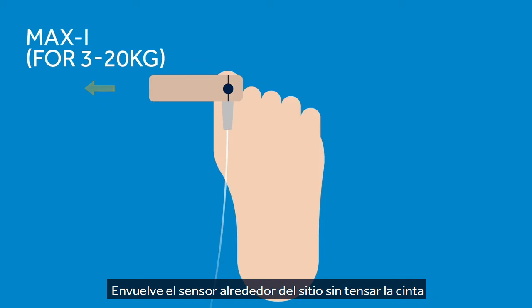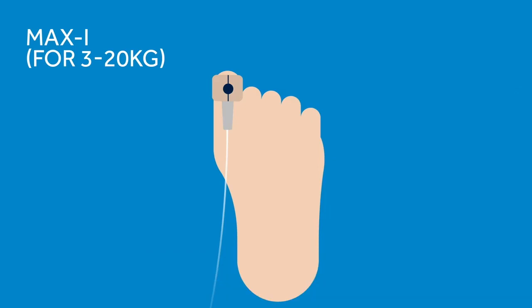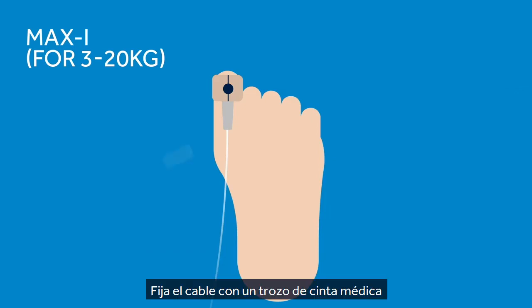Wrap the sensor around the site without stretching the tape, so the optical components directly oppose each other. Anchor the cable with a piece of medical-grade tape.